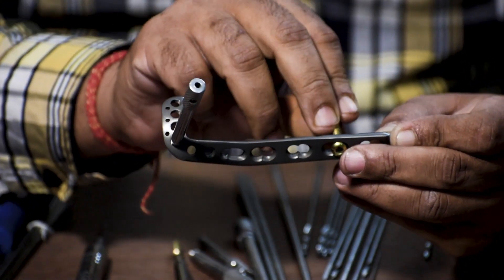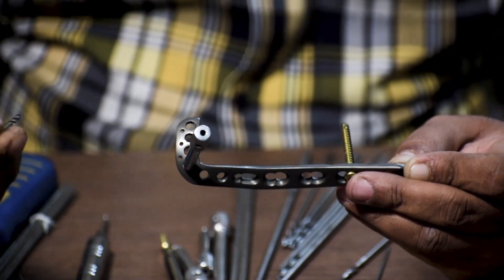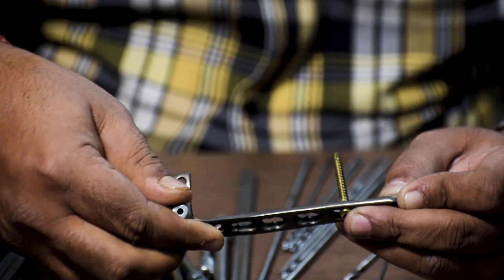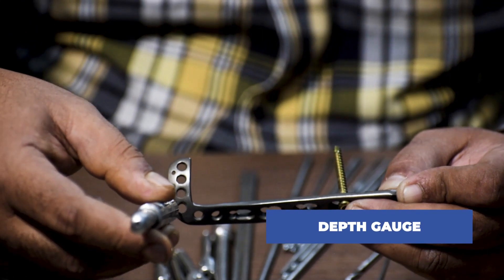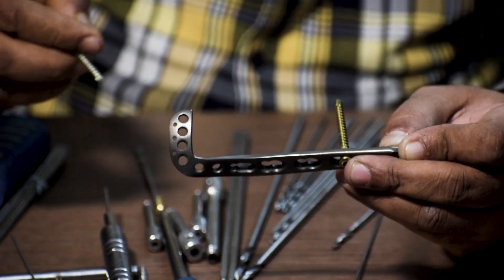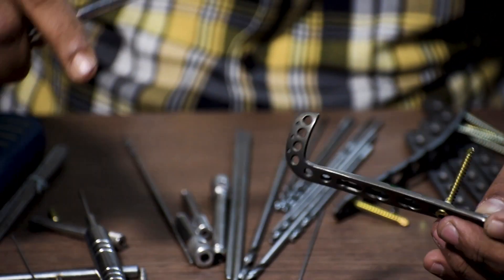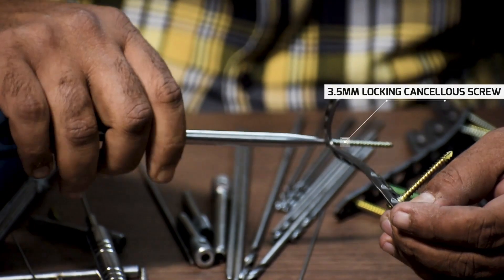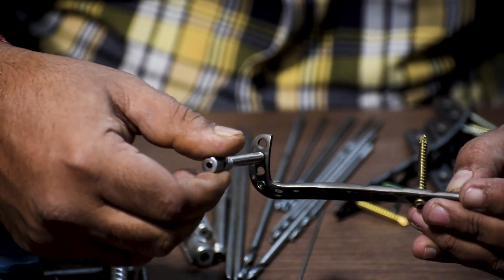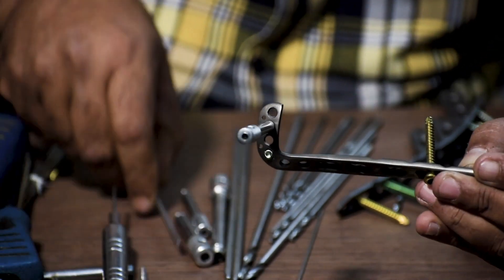Once this screw is fixed, we move forward to fix the distal head of the plate. To fix a 3.5 mm cancellous screw, we use a 2.8 mm drill bit and drill through the drill sleeve. For cancellous screws you don't need to do any tapping. Again we use a depth gauge to measure the length of the screw — here we are taking 35 mm. We then take a 3.5 mm locking screw which is 35 mm in length and with a 3.5 mm screwdriver we fix this screw. To fix the other screws in the distal end of this plate, we repeat the same process of fixing the drill sleeve, drilling through it, and then fixing the screws.